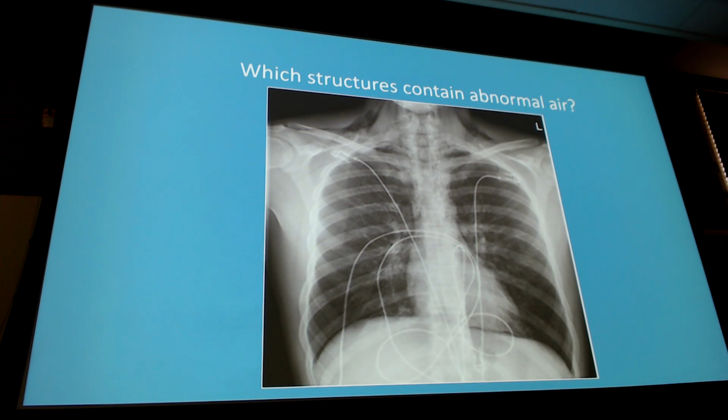They had some ruptured blebs, which we'll look at in a little bit, or bullae, or some alveoli that caused the pulmonary interstitial emphysema, which then went into the mediastinum, which then went into the subcutaneous tissue. All of these signs, though, for pneumomediastinum. So what does that mean? If you see subcu tissue up here, you should be looking for a pneumothorax, just to make sure.